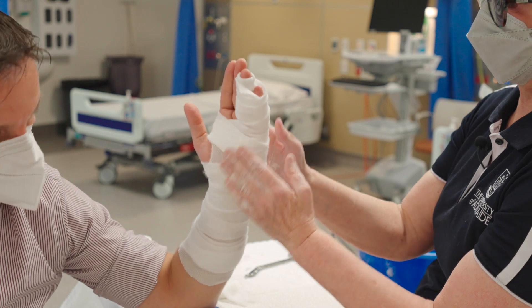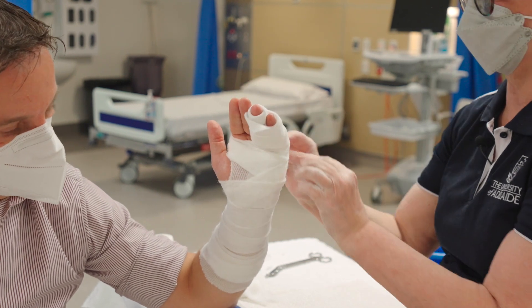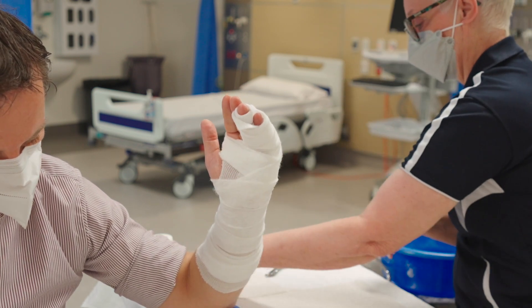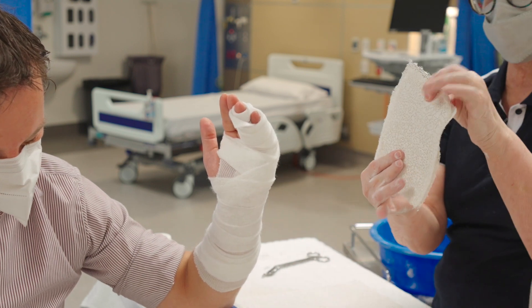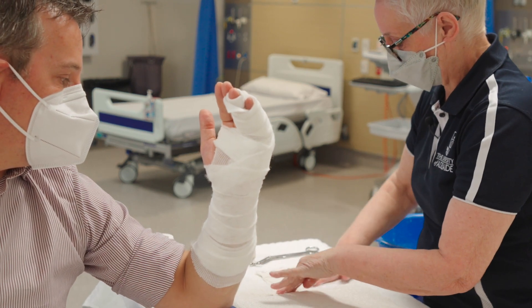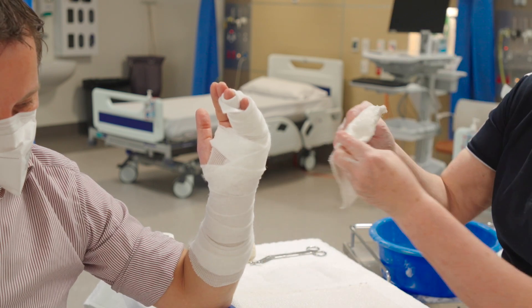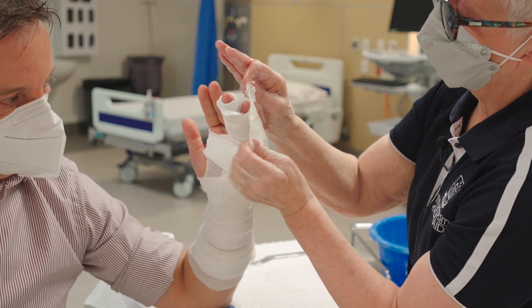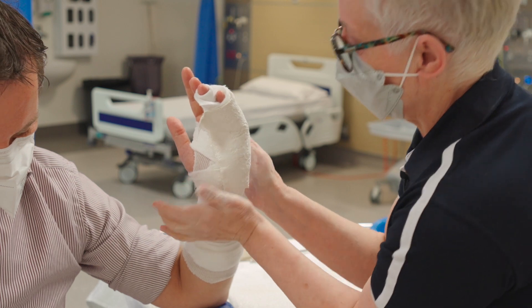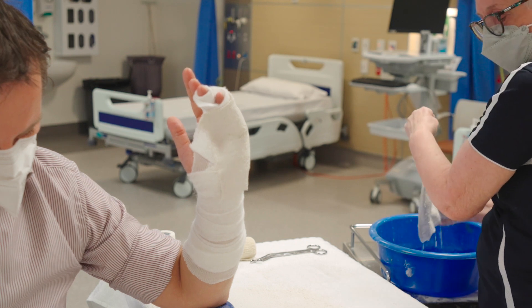Now that the padding is on, position the patient with the wrist cocked back and the two fingers angulated down at about 70 degrees. Make sure you have all the coverage needed. Grab the small piece of back slab, place the plaster in the water, then press it on the table to get all the gypsum into the linear weave and ensure there are no creases. Place it as shown, keeping fingers out as much as possible. Use the flats of your hands so you don't create any indents, and don't take too long as it starts to set pretty quickly.